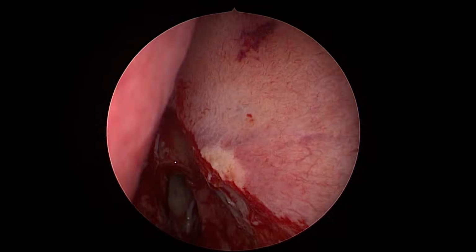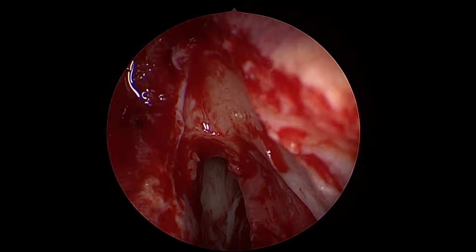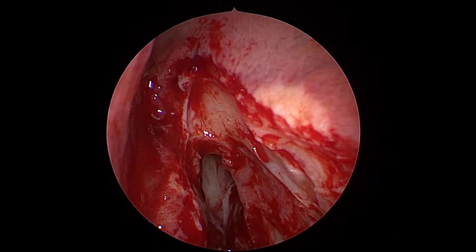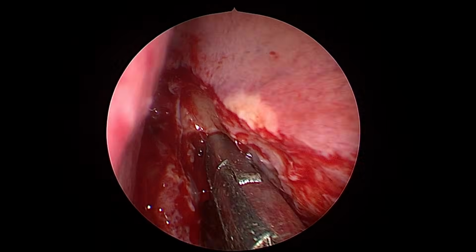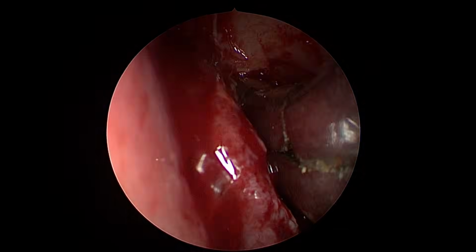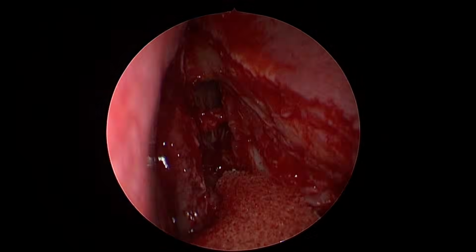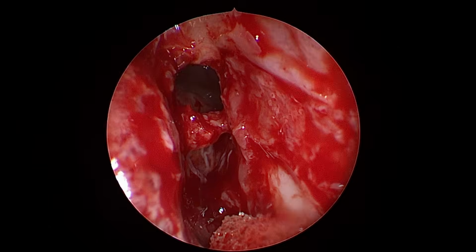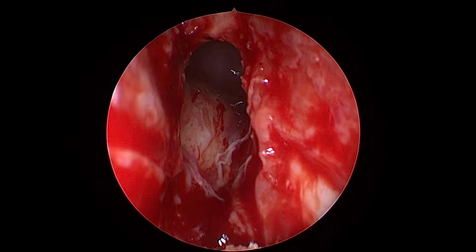Now, the challenge is, see this is the posterior table and the beak is so overhanging. This beak will not allow my solution to go freely. Now what I am doing, this is my special articulated punch from Karl Storz. See, I am removing the beak to make the solution reach more easily. Whatever the overhanging beak, you can remove.